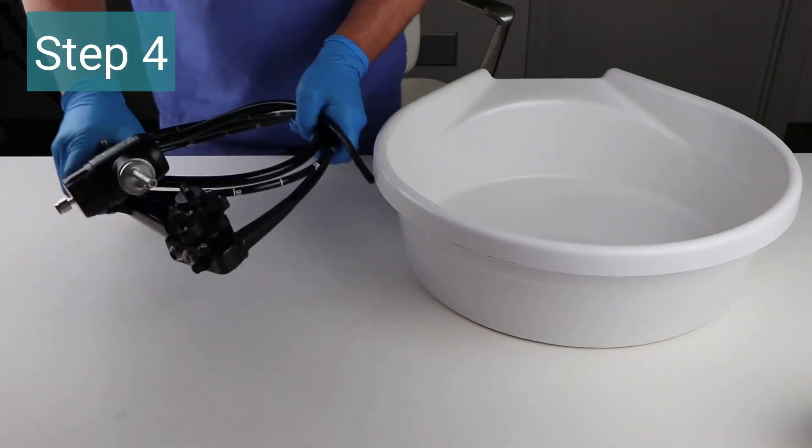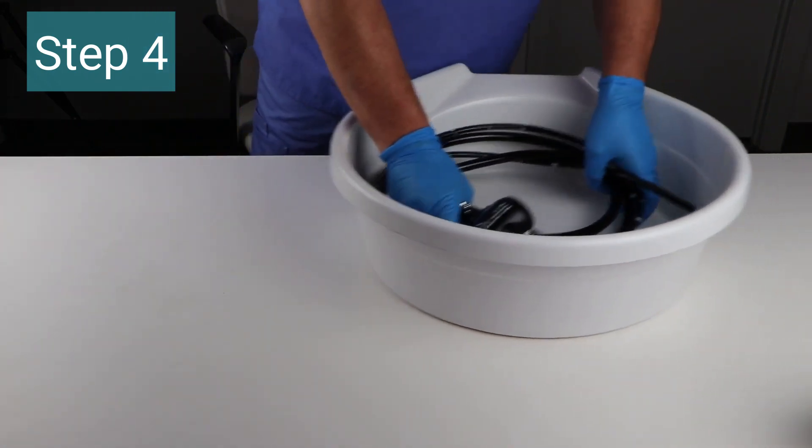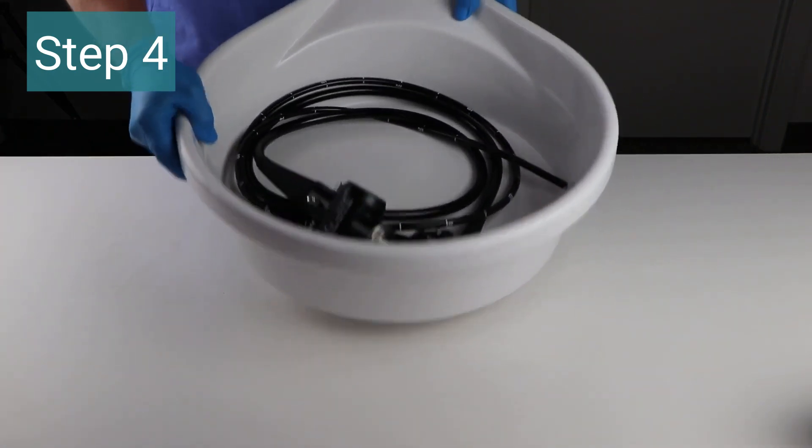Step four: your endoscope is now pre-cleaned and ready for transport or transfer for cleaning, sterilization, and storage.